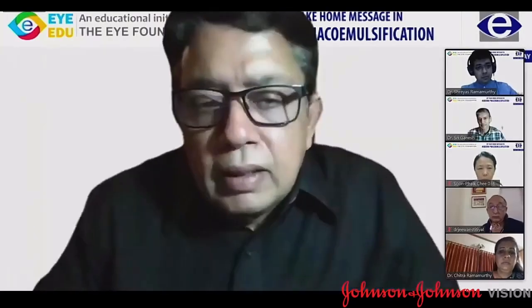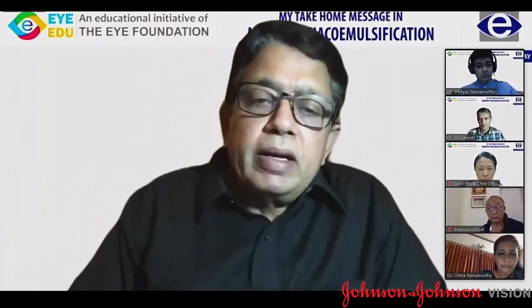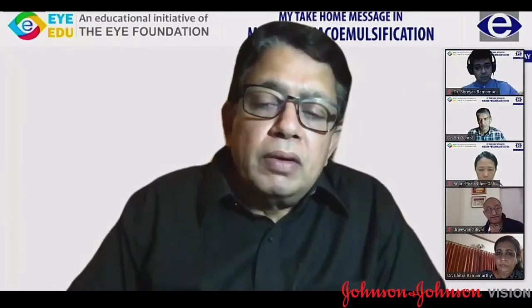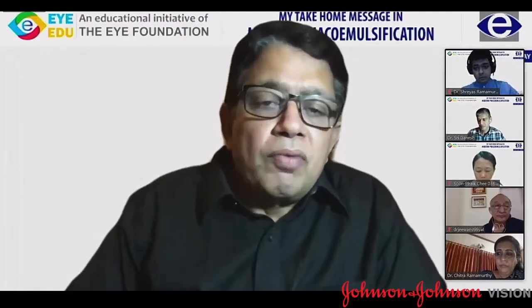I think it's been a nice presentation, a good discussion. Basically, we want to leave behind a take-home message. I believe that when it comes to biometry, there are two aspects to it. One is acquisition of data and the other is usage of data to get the optimal results. As far as acquisition of data is concerned, all of us would agree that optical biometry would be the way to go, and there are excellent instruments available today. But not all of us can afford it.